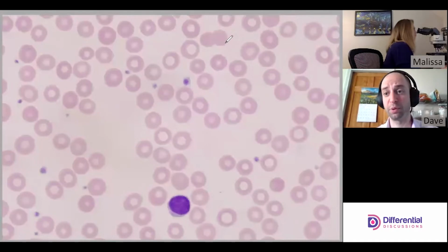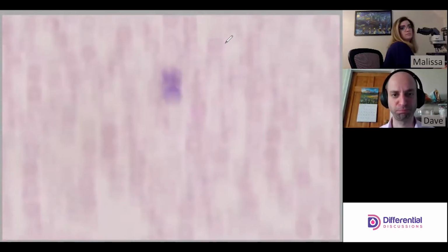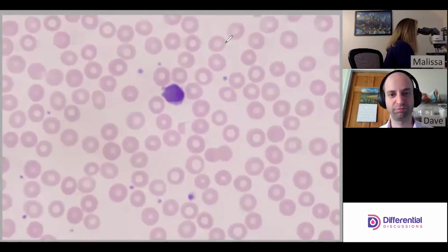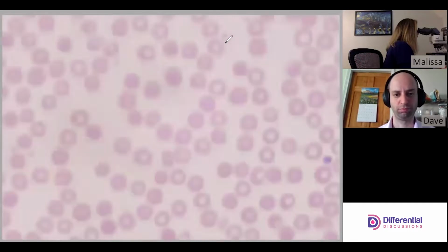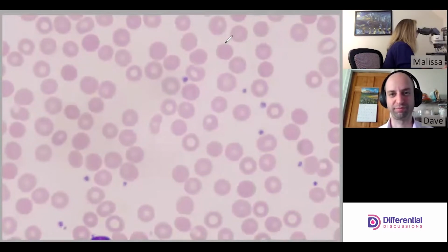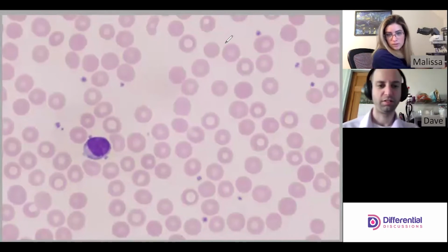Now the lymph, and now that we brought up chromatin pattern, we're looking at that nucleus, looking at the density, the dark, deep purple, consistent with a mature cell. Another one. There was one right underneath it. Right there. Lymph. Another lymphy lymph.